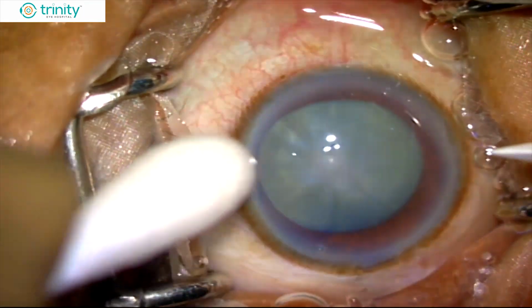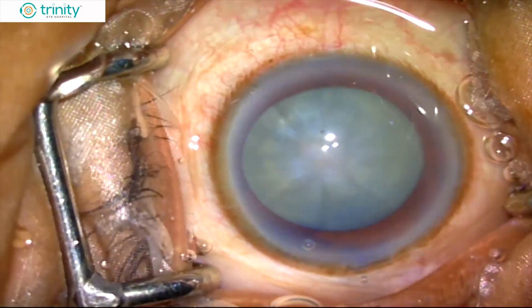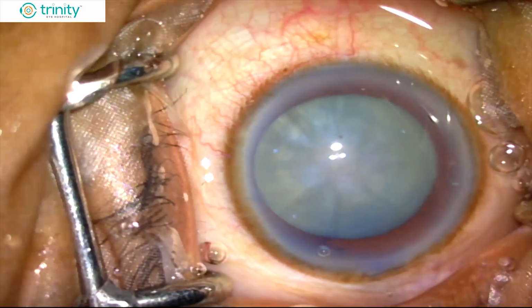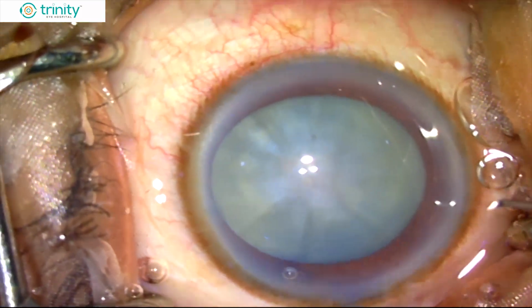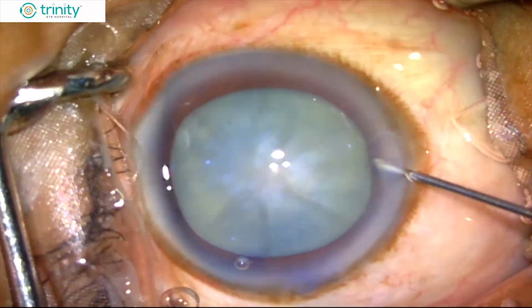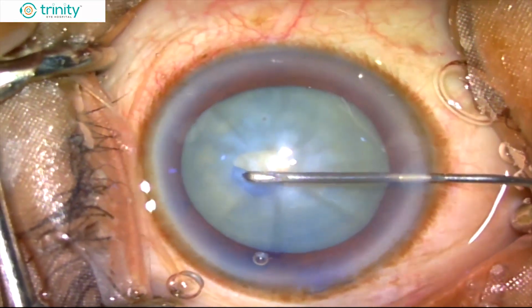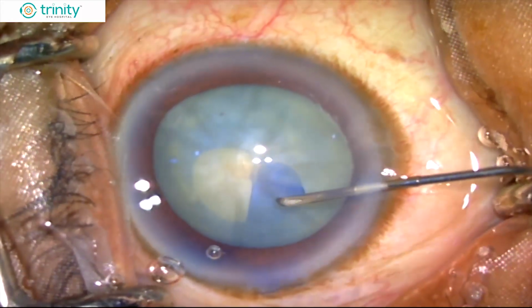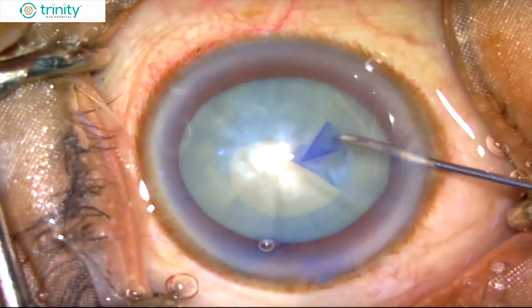I normally use two side ports around 2 to 2.5 clock hours from the main port. This is for the bimanual aspiration, and I use the side port for the rhexis also. This is mainly because I feel the stability of the anterior chamber during the rhexis is very important in order to avoid the rhexis extension. In these kinds of cases, when you go through the side port, there is no collapse of the anterior chamber and the rhexis is completed in one go without need for multiple injections of the viscoelastic substance into the anterior chamber.